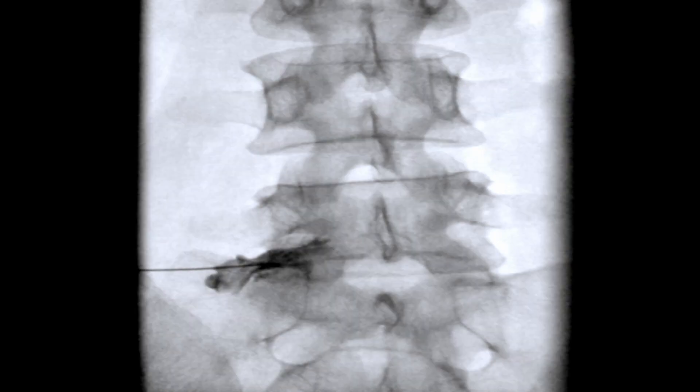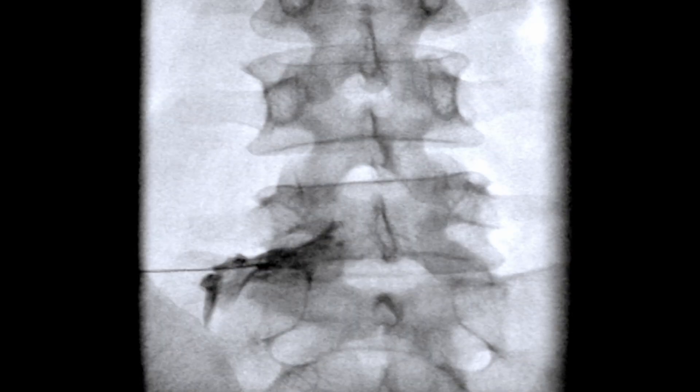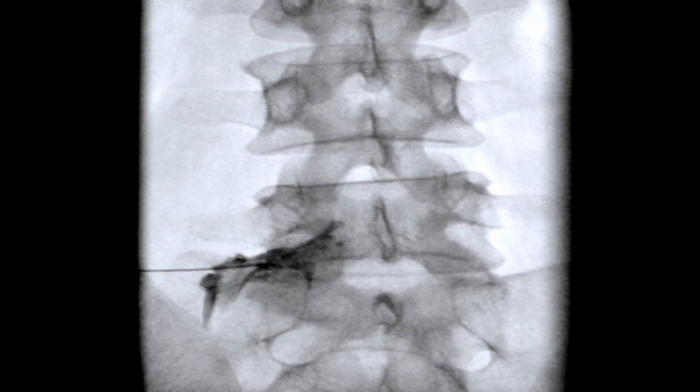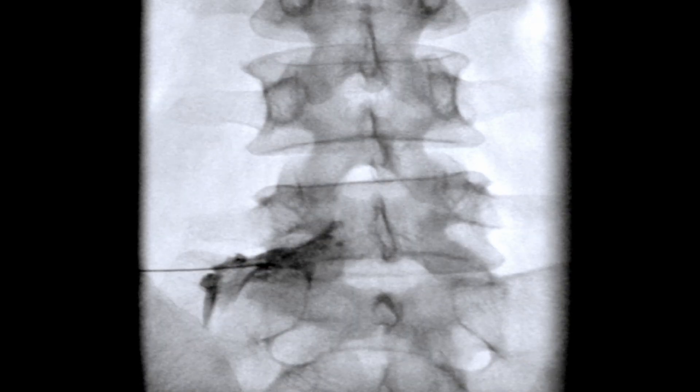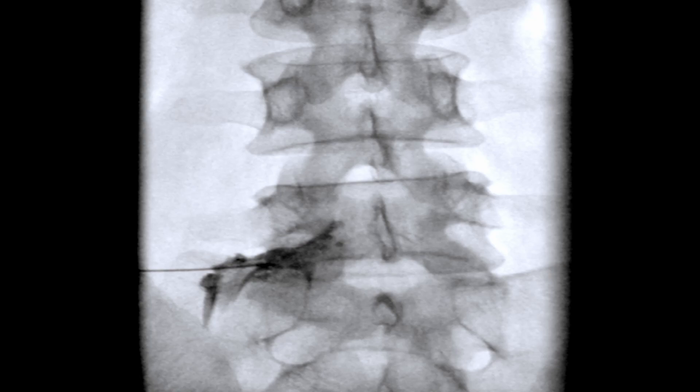The primary indications for the infranural approach are discogenic pain at the same level, foraminal stenosis at the same level, and lateral disc herniation at the same level.